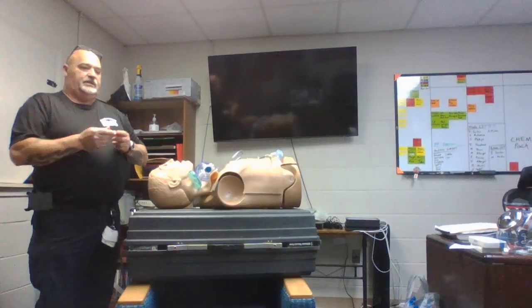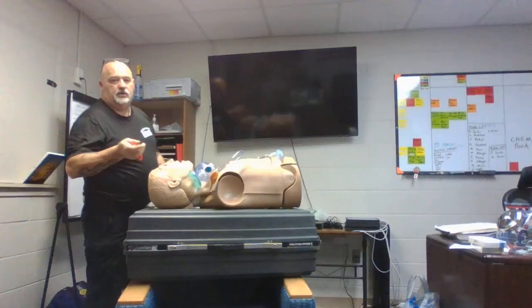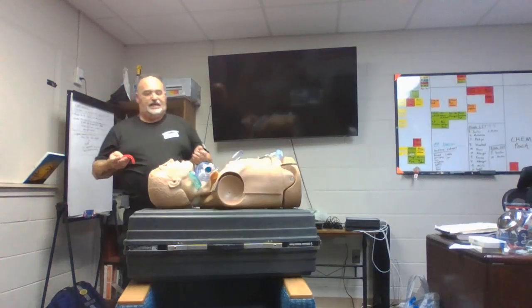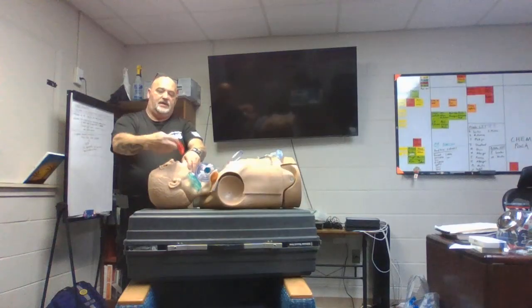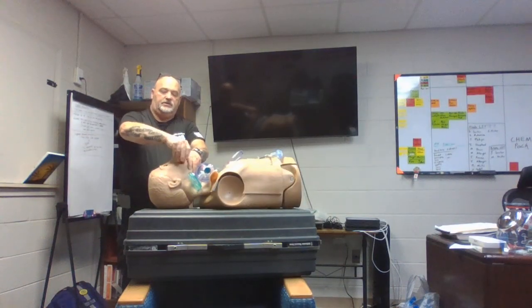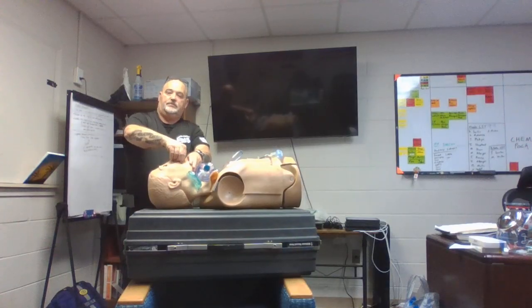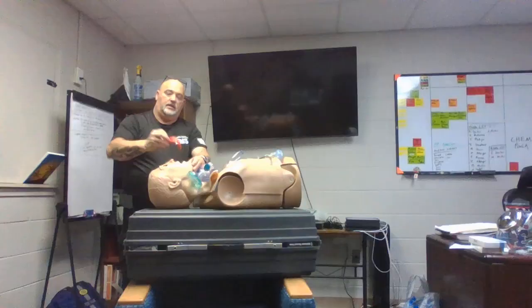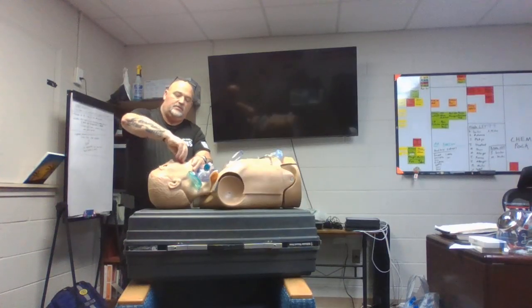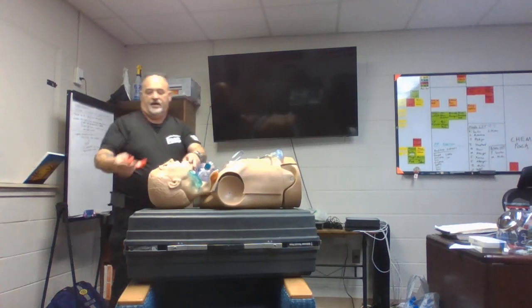What's important about these is I've seen it, I've heard it, I've watched it on calls and classes and training. These airways go in backwards, right? You can go sideways, if you will. And once it goes in, you rotate it back down to where it's supposed to be. You don't just plop it in there. A lot of people will tell you to put it in backwards and start rotating it down. When you get down, it should be turned towards the patient's body, not the head.